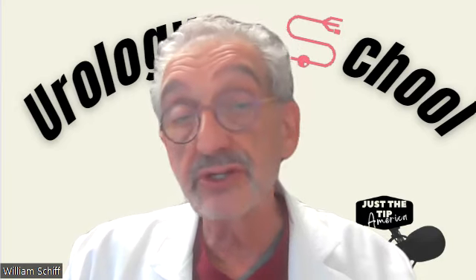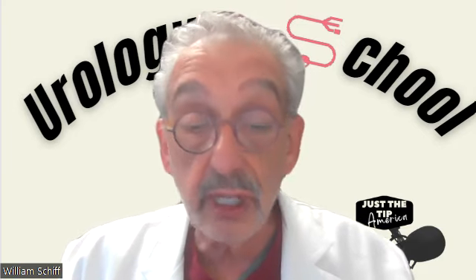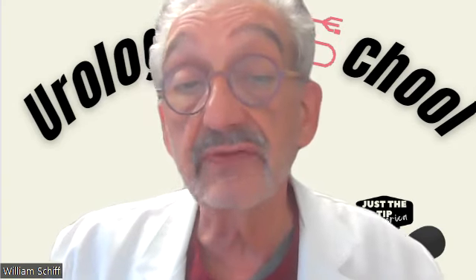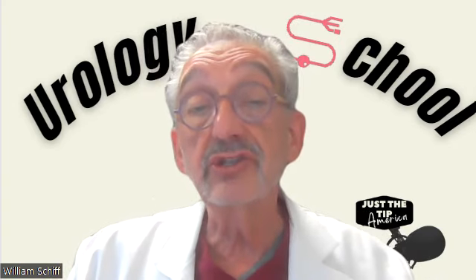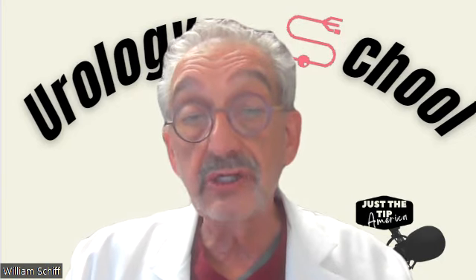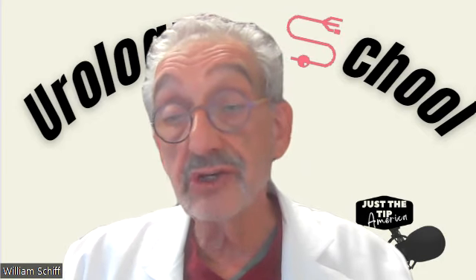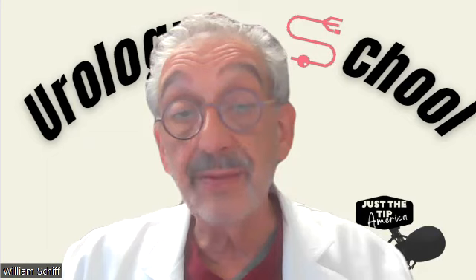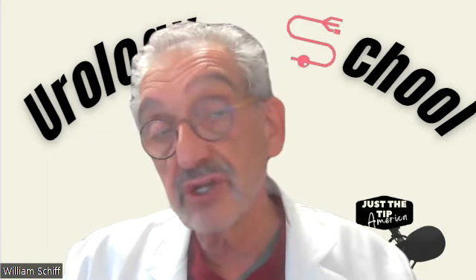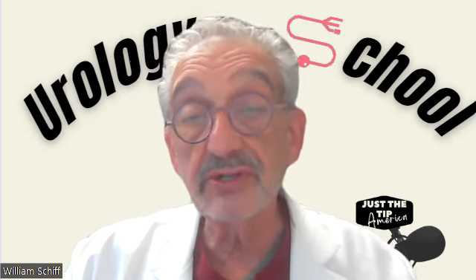It's great for patients with previous negative biopsies, for pre-surgical planning of radical prostatectomy, and for active surveillance. A lot of times we have protocols that instead of doing routine biopsies, we can supplement with MRI visualization and utilizing MRI-directed prostate biopsies. It's also great for assessing local recurrence of prostate cancer after a prostatectomy.